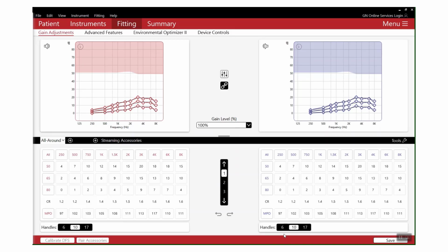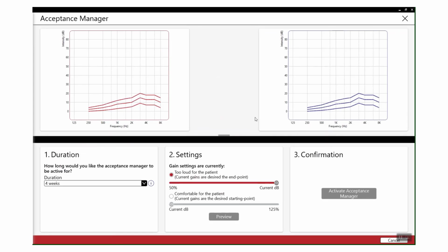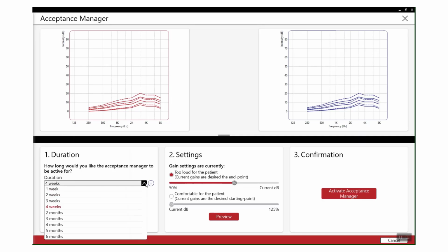Now what you could do is go into your gain handles and reduce those high frequencies, bring them back and increase as is appropriate. Alternatively, by clicking on menu and going into acceptance manager, what you can do is set a comfortable starting point using this setting here. For example, you might want to take them to 80% of their target prescription. You can also set the duration of how long you'd like it to be running for.